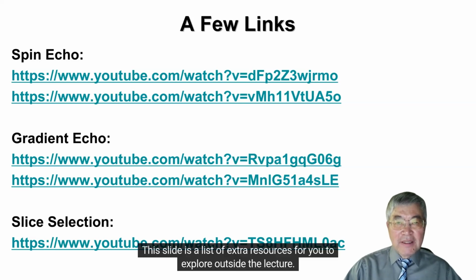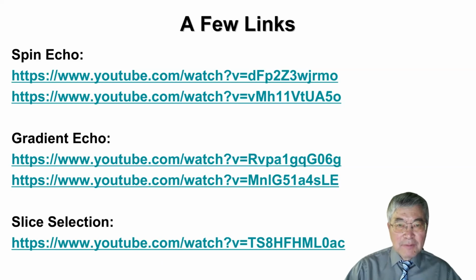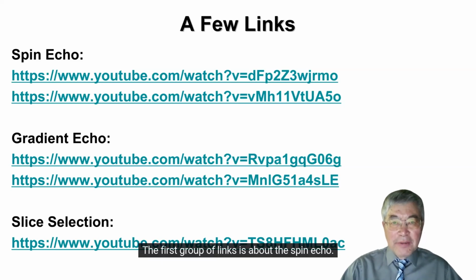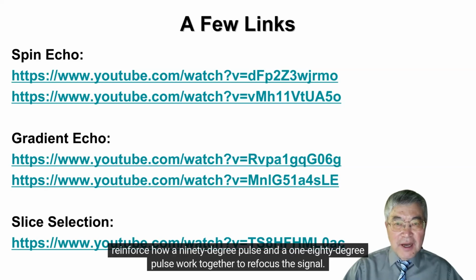This slide is a list of extra resources for you to explore outside the lecture. These links are short videos that explain some of the key concepts we discussed in more detail. The first group of links is about the spin echo. Spin echo is one of the most fundamental sequences in MRI, so watching those demonstrations will help reinforce how a 90-degree pulse and a 180-degree pulse work together to refocus the signal.